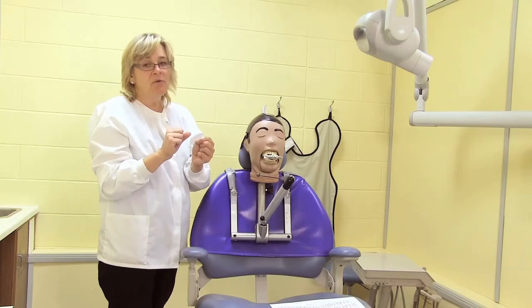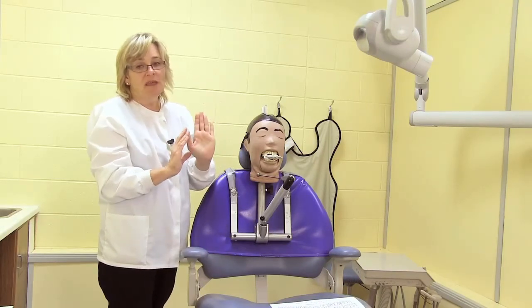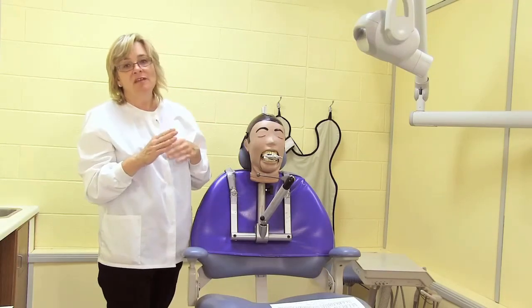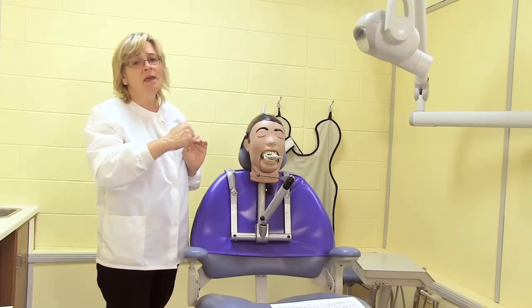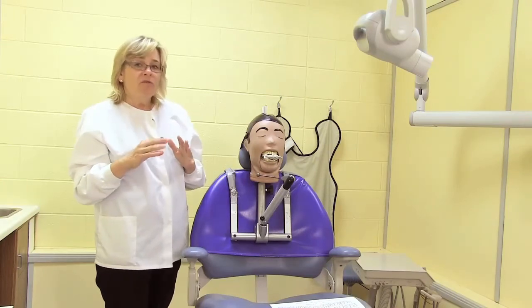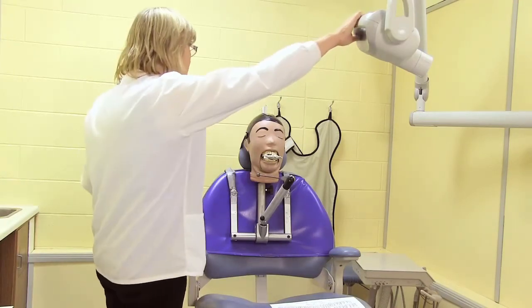Even if it doesn't always work, it's probably our best way to determine the angulation. Sometimes because of anatomy, for example palatal tori or mandibular tori, we may have to move the film slightly away from the teeth. However, that's our principle, and then we work with our angulations considering that type of anatomy as well.